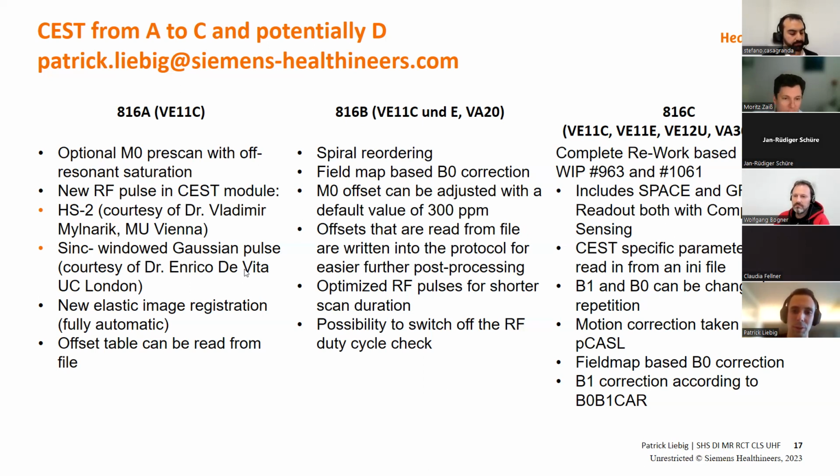All right, one last question. This was the follow-up about the regular user mode or advanced user mode to run the sequences. Do you know what is meant by that, Patrick? I'm unsure, but is it first level mode in terms of SAR or simulation? For installation, yes, you first would have to deactivate all the firewalls and so forth, and therefore you need to be in the advanced user mode. But afterwards, it runs like any other sequence in that sense.